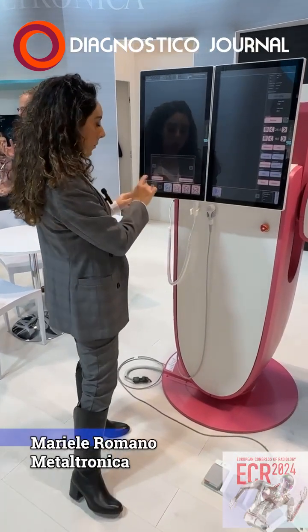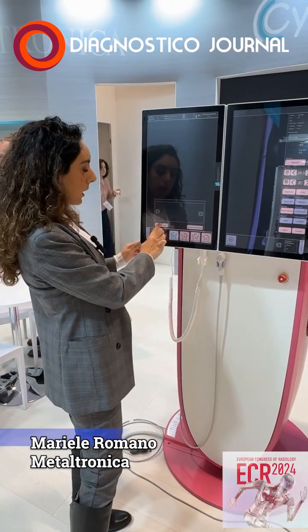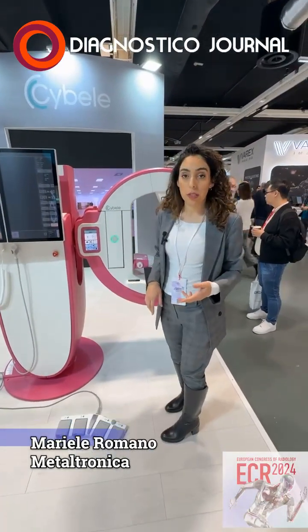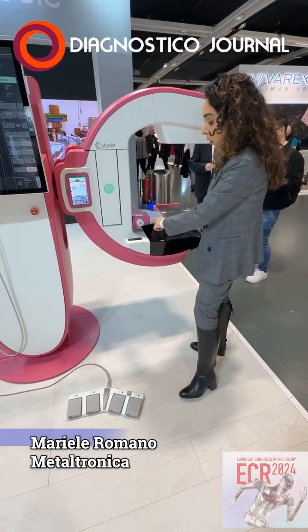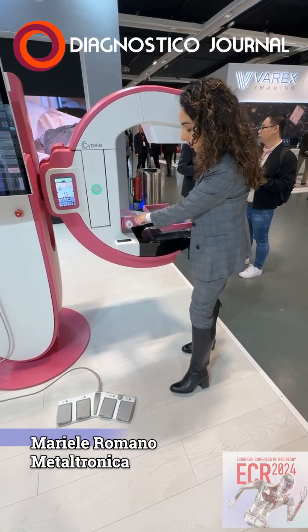So we will go with LCC in FFDM. We just click here, acquire image. We compress the patient. We have 3 ways of compressing the patient: this option, and the pedals. Once compressing, here the force of compression shows up.